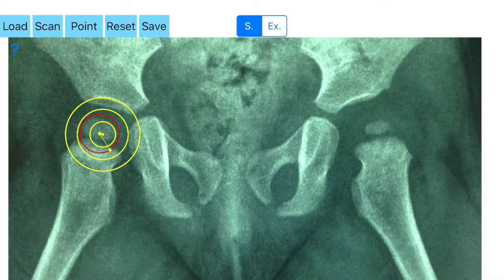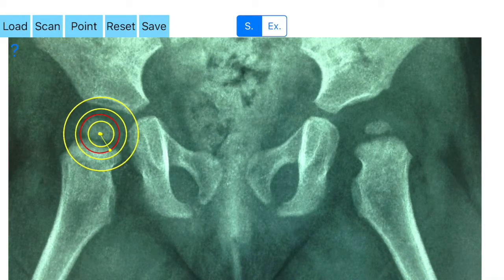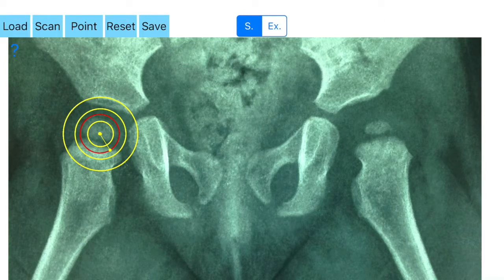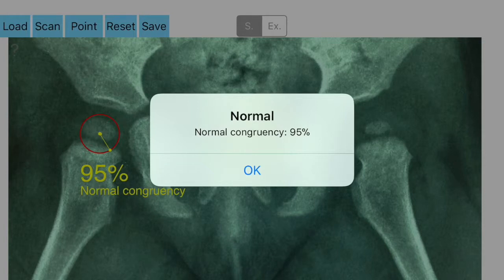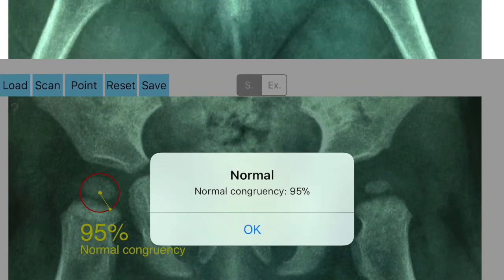By clicking the point button, you mark the center of the acetabulum. When the center of the best-fitted circle of the acetabulum coincides with the center of the femoral head, the congruency of the joint is considered 100%. Normal values according to the mechanics: less than 83% are abnormal. The results are printed on screen. This app is particularly useful in clinical settings where you need quick results.